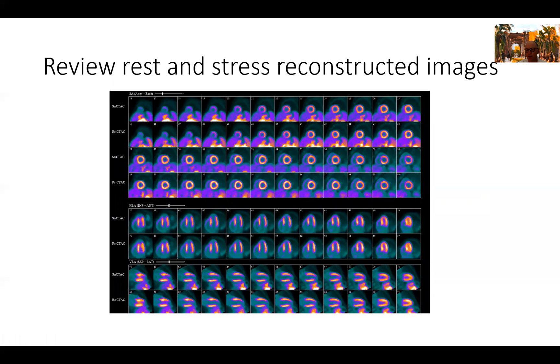The next step is to simplify our life. So I never review the images all together. I always review the rest and stress first. My first task here is to define the presence of ischemia or fixed defects. So we can see here in the short axis, displayed with stress images on top and rest images on the bottom.